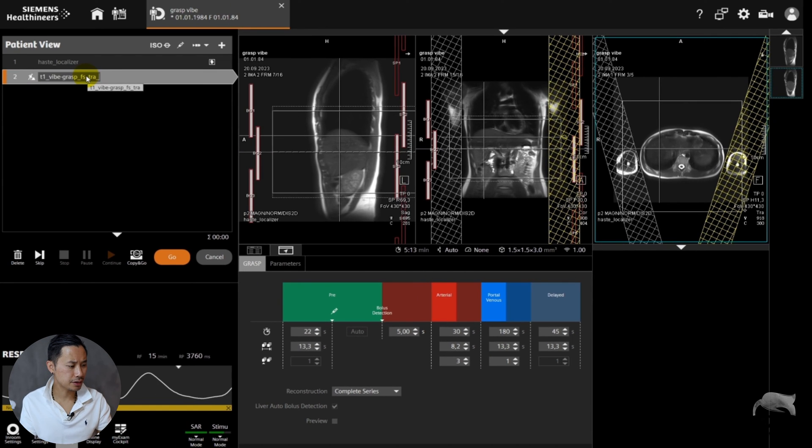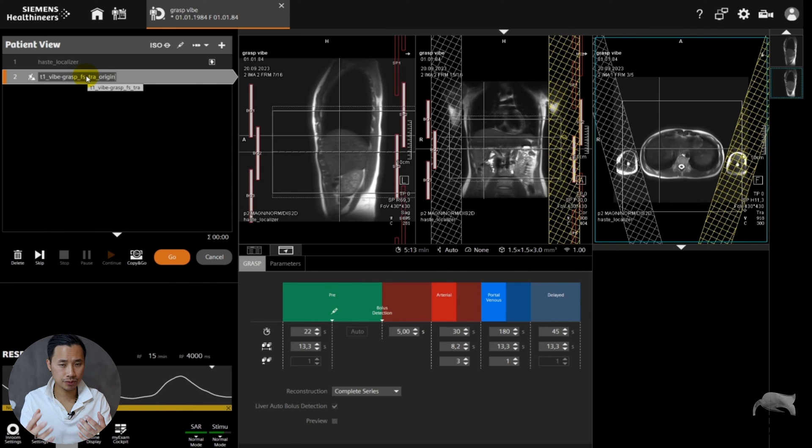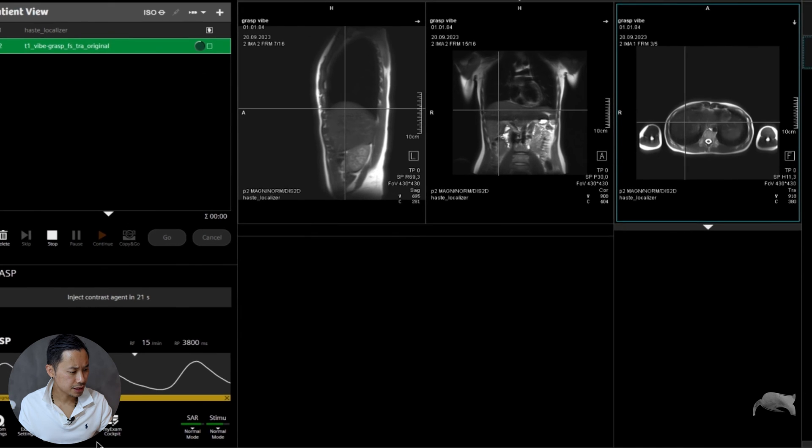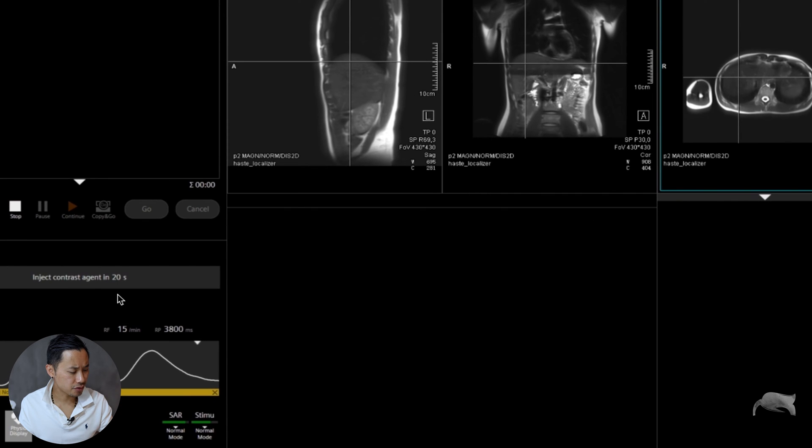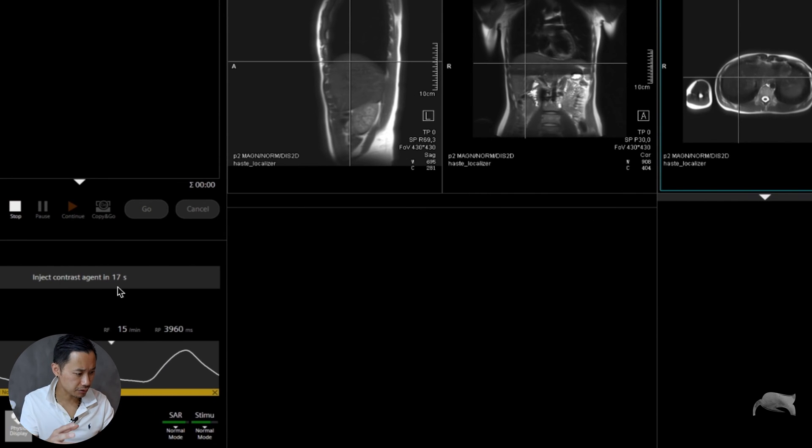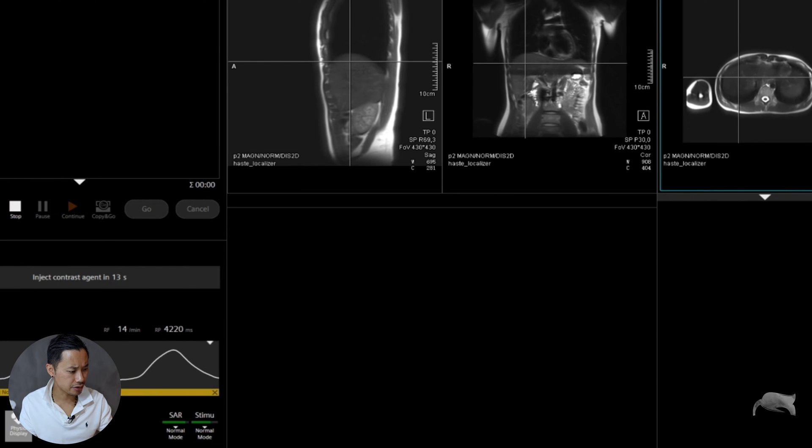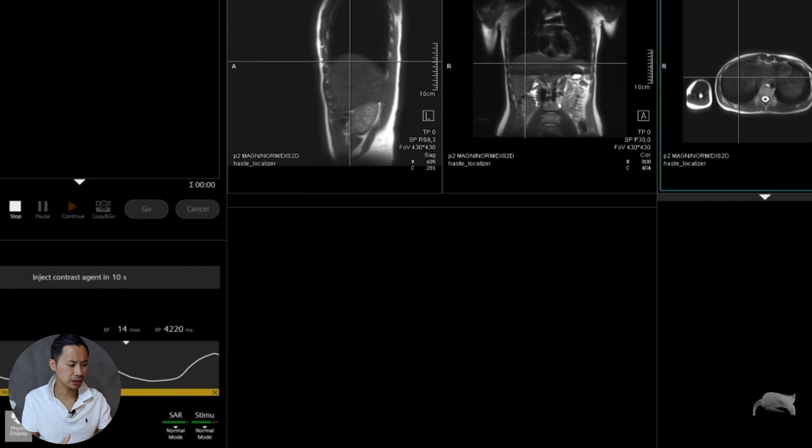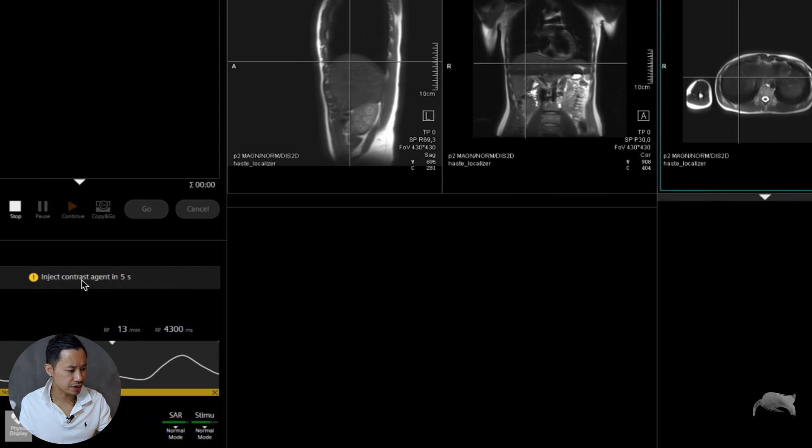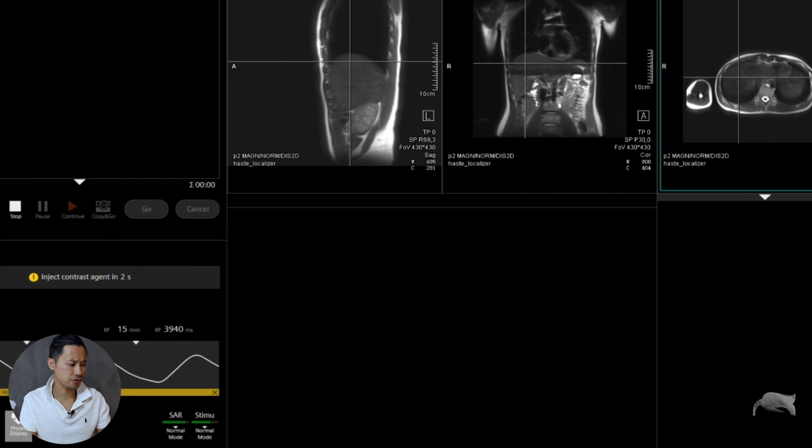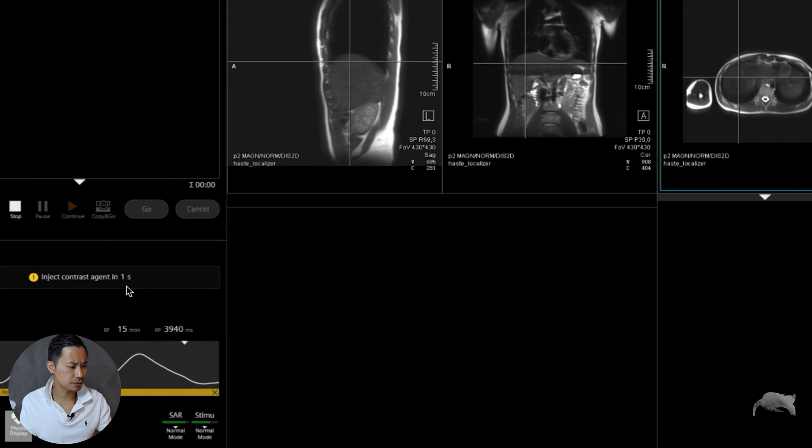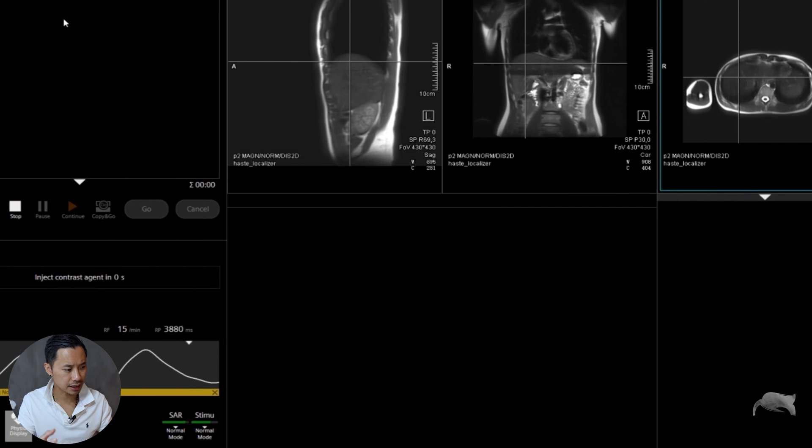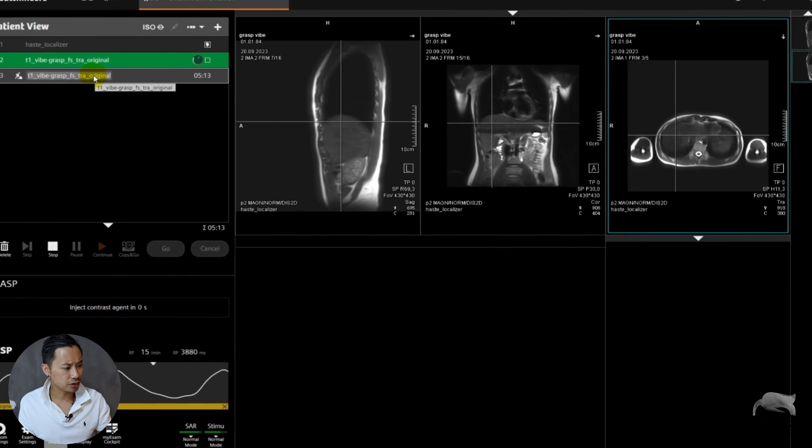I'm just going to rename this with the original so we know which one. We're going to prepare and start that one. You see the countdown is right here. It went from 22 like I told you and it's counting down. Inject contrast in 15 seconds. You can see the automatic respiratory here. You can see the patient is breathing gently, breathing normal as it should be. Around five seconds we get a change right there. It will notice that soon you will inject contrast. Whenever it reaches zero, there you go. Now you inject contrast. It will automatically continue for five minutes.